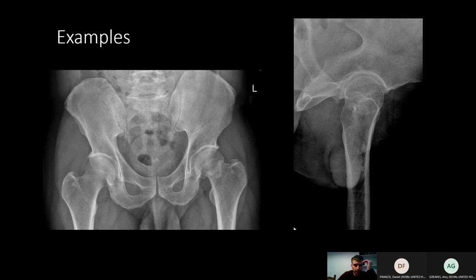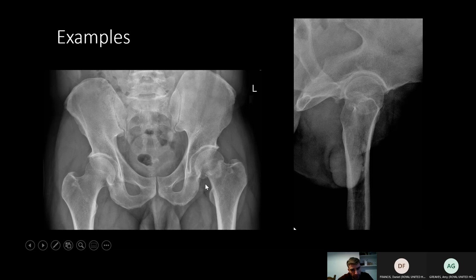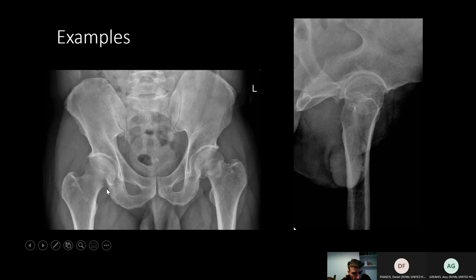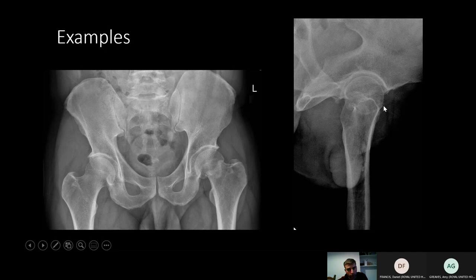Here's a fairly subtle subcapital neck fracture. If you follow along you can see there's a bit of increased radiodensity at the bottom of the head. On the normal side we've got a nice curve — Shenton's line — whereas that becomes disrupted on the left-hand side. On the lateral you can probably see a small step here indicating a fracture. This is intracapsular, so it's going to need replacing.